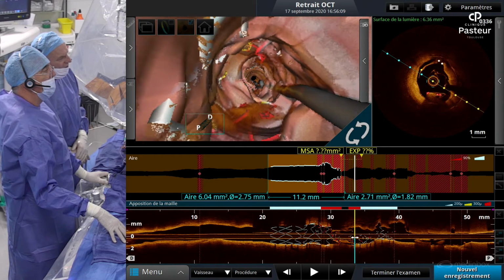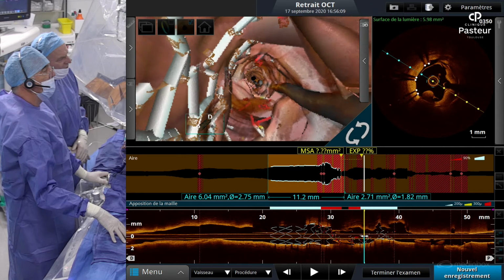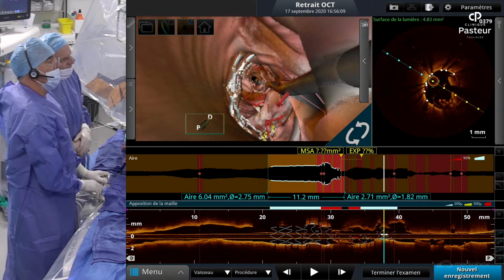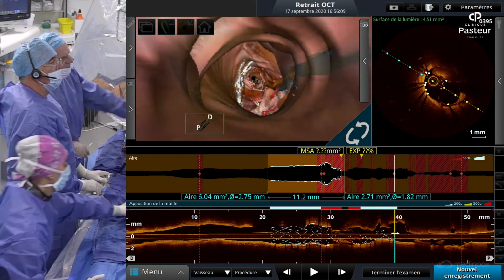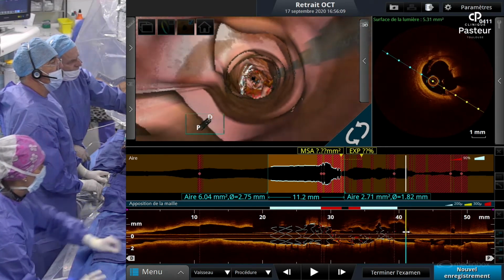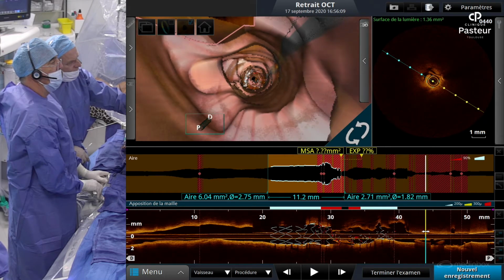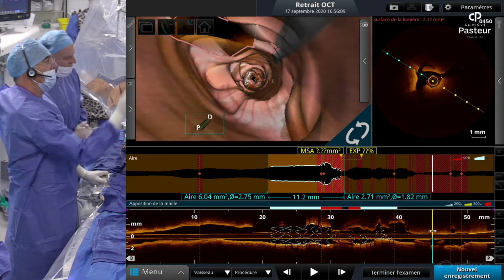Okay, okay, okay. Huh. Impressive. Here it is coming. Yeah. Very curious, yes.